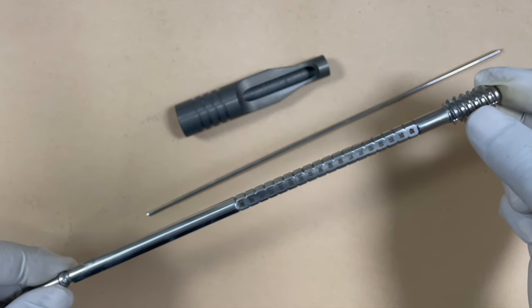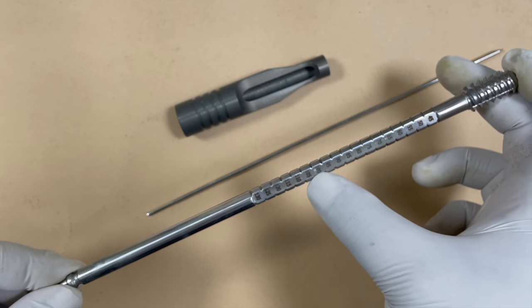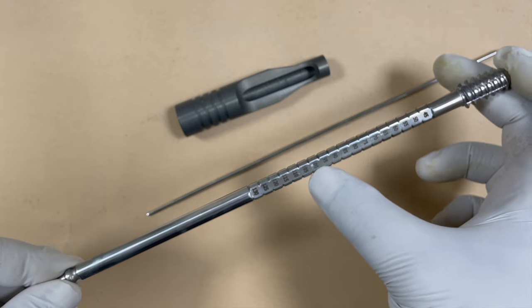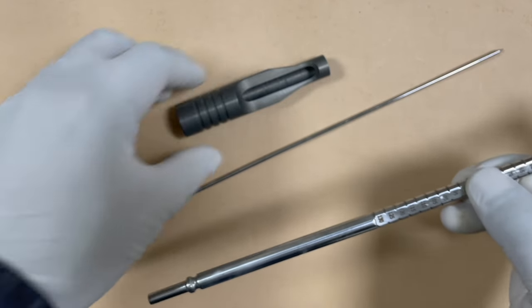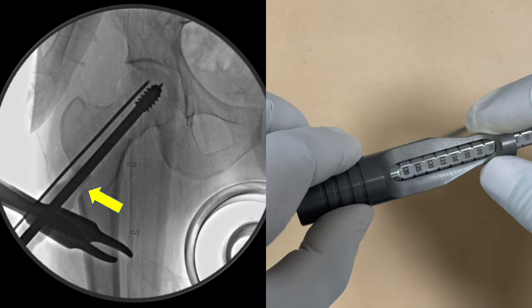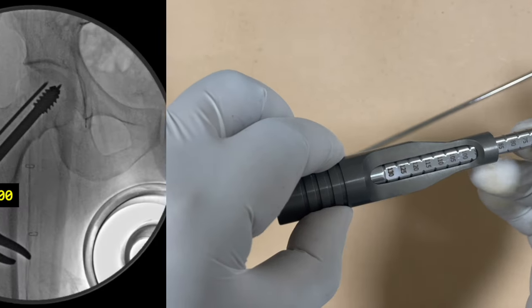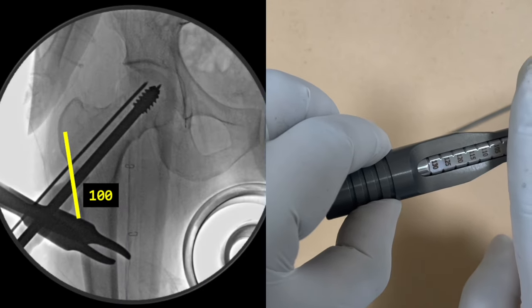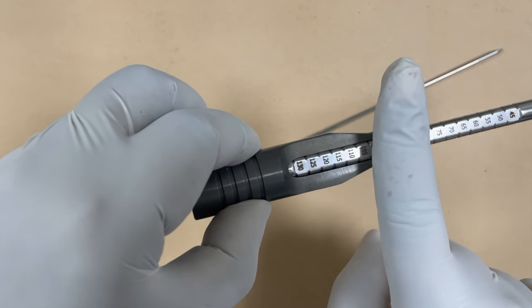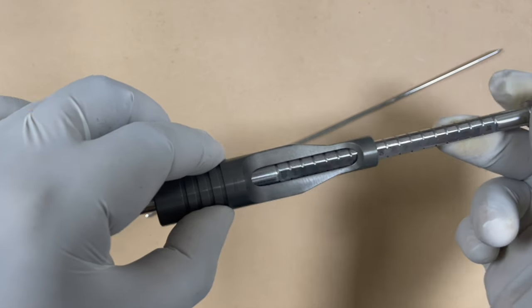The threaded tap helps in inserting the lag screw. There are markings on the tap, so tapping has to be done according to the size of the lag screw. If the appropriate screw size is 100 millimeters, we tap till the 100 marking. The tap goes inside the tunnel created with the triple reamer. You will be able to see the marking over the hole — for 100 millimeters, you check the junction of the bone and the tap sleeve, and tapping is done at the 100 marking.